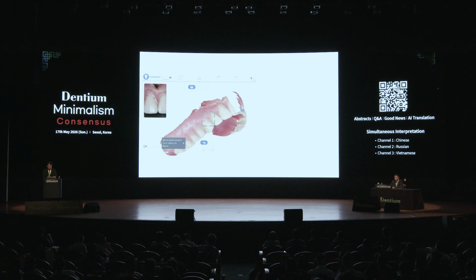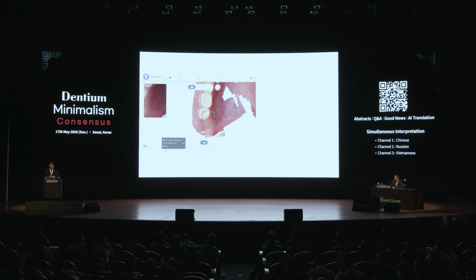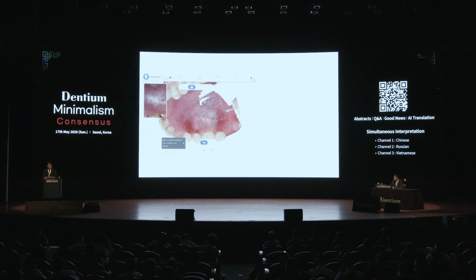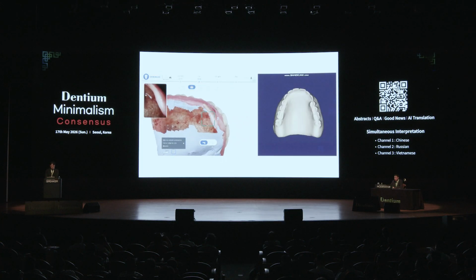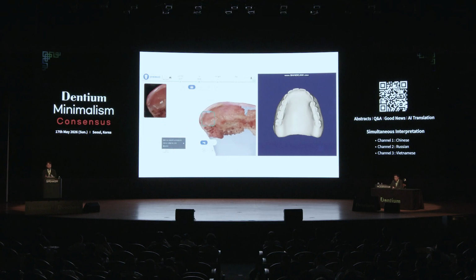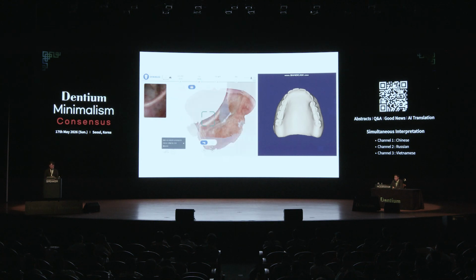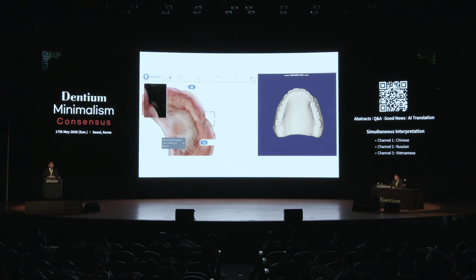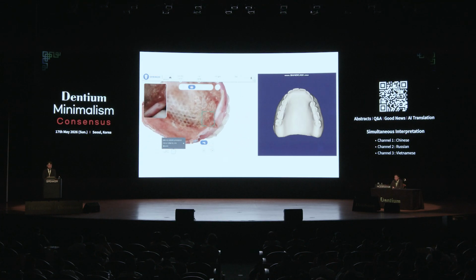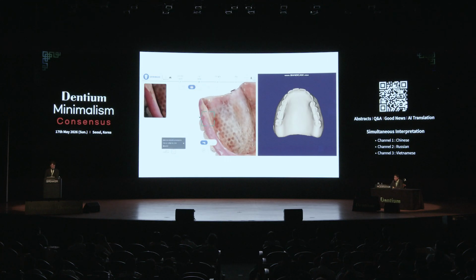To reduce the drift error, AI finds the matching features in each frame and helps to align the data more accurately. A CNN-based model can be used for this task. This becomes even more critical in denture cases, where the inner and outer surfaces need to meet precisely along a single line for a complete scan. For this reason, in the past, denture duplication was difficult with an intraoral scanner, so it was mainly done with a tabletop scanner. But now, anyone can do it with an intraoral scanner.